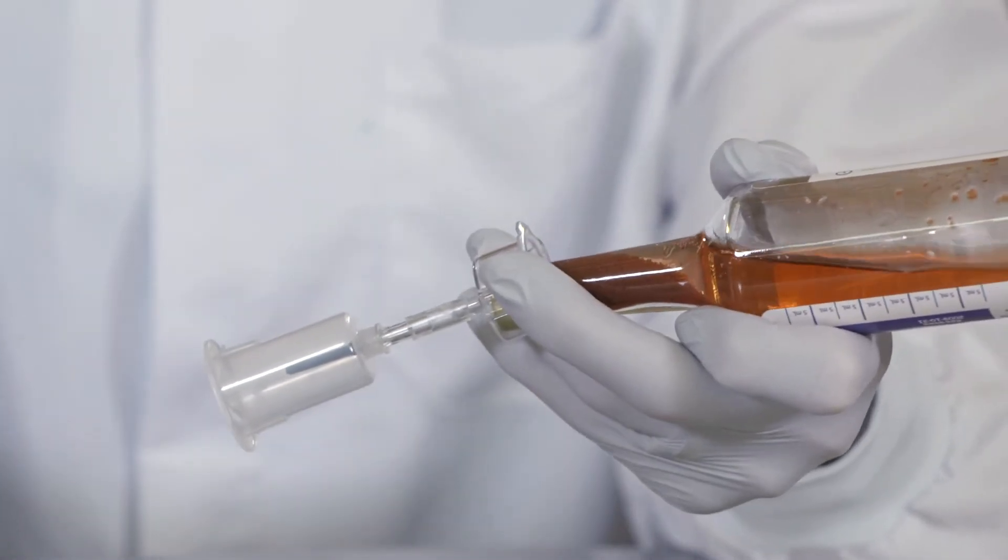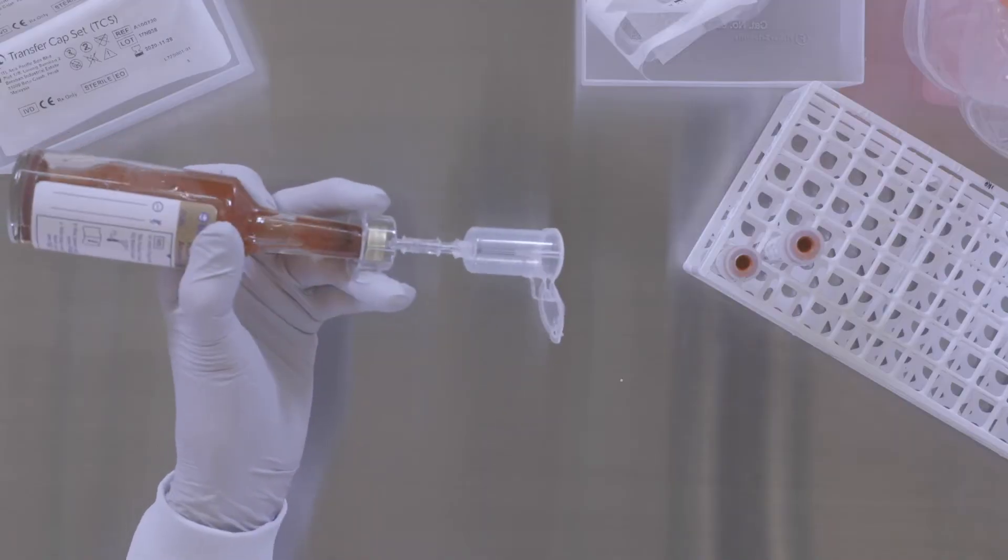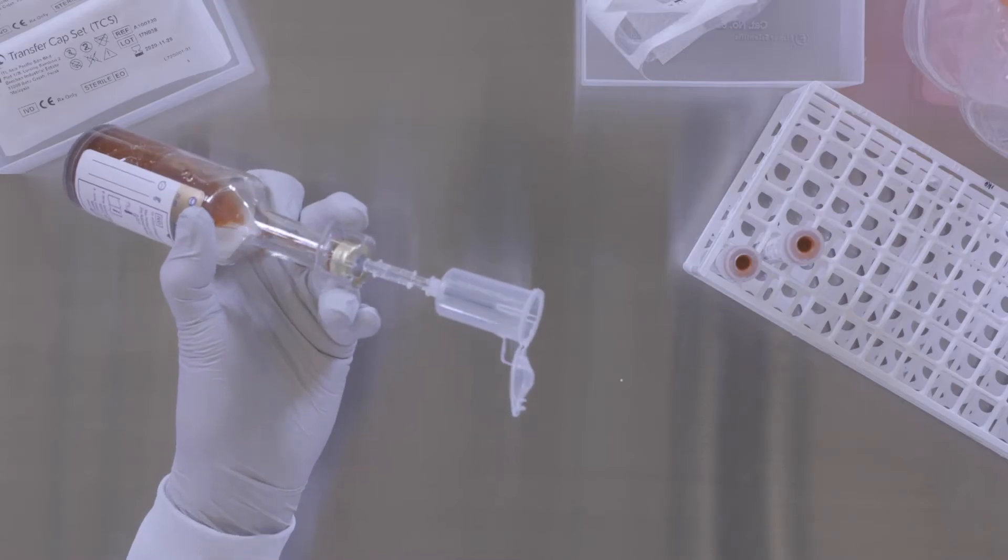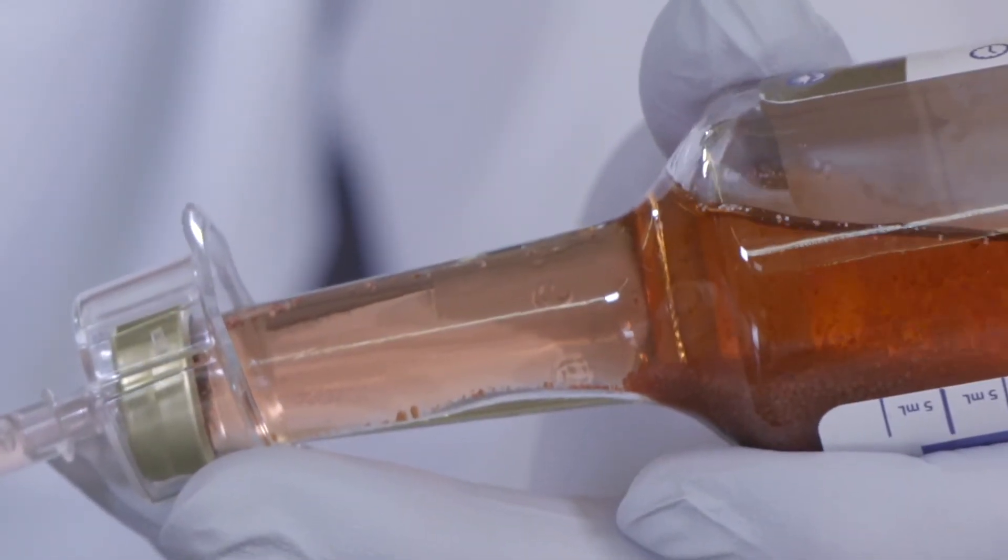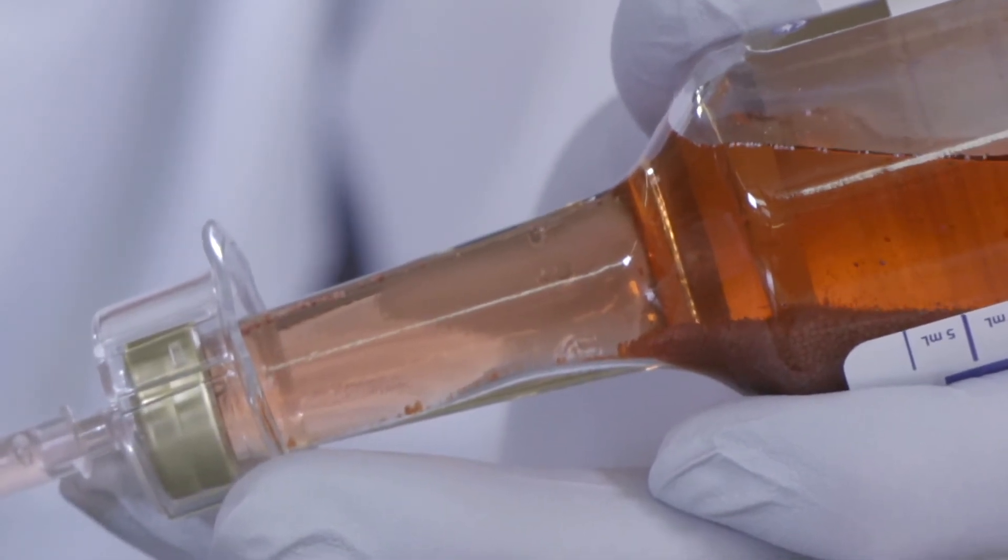If the resin beads obstruct the transfer capset piercing tip, try tilting the bottle back and forth to move the resin beads away from the piercing tip. Once resin beads have settled, tilt the bottle at an approximate 45 degree angle so resin beads gather along the side of the bottle.